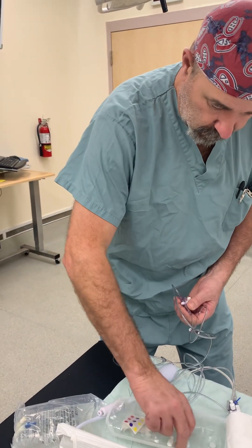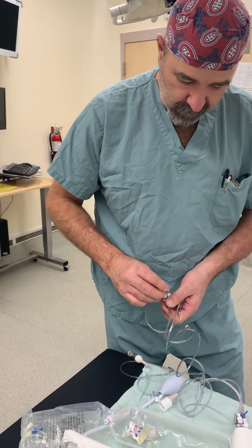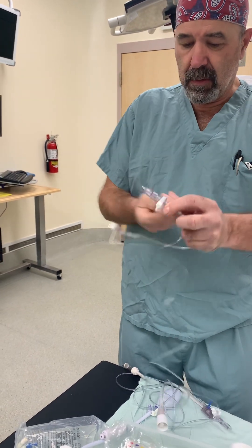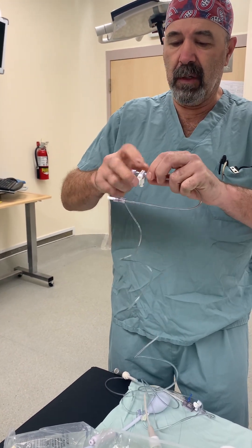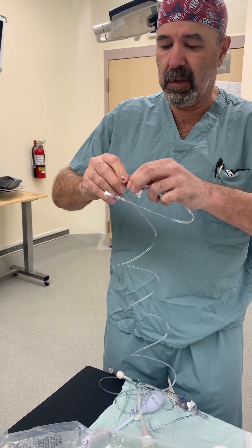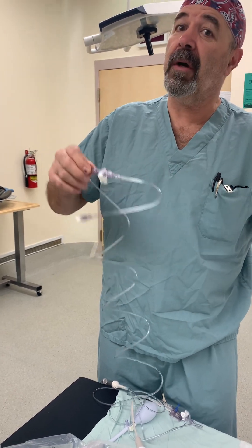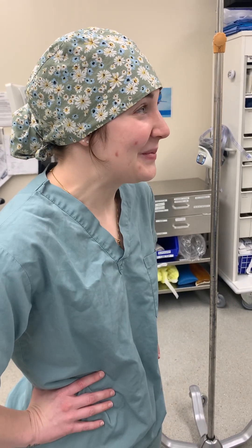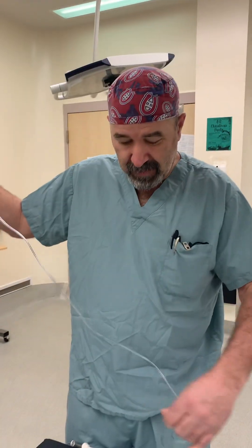We will put the other cap on — I can find it right here. The next thing we need to do is tighten our connections. There are a few connections, so tighten this one — make sure that doesn't come apart. If it comes apart, the patient will exsanguinate.